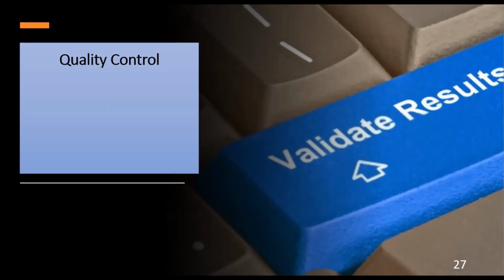that we perform. So, QC is not only performed in chemistry. There should be QC in serology, in hematology, in bacteriology, in parasitology, in AUBF, in urinalysis. There should be a quality control check. Again, this quality control check will help us determine whether the results that we obtained are valid and good to be released. Now, in agglutination testing, the quality control check that we do is through the use of the positive and the negative controls.